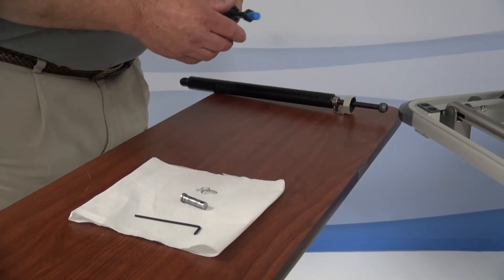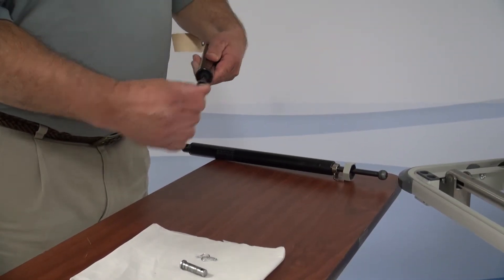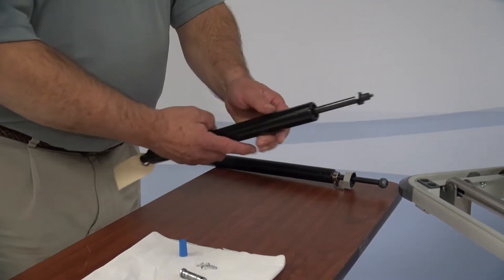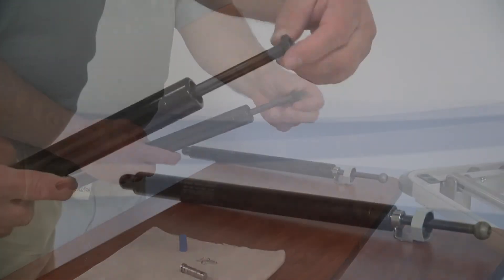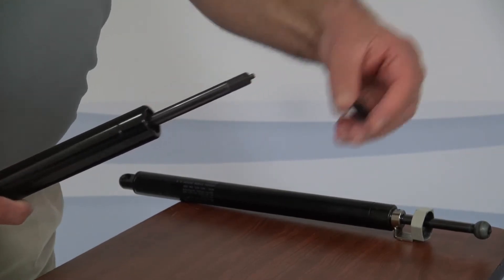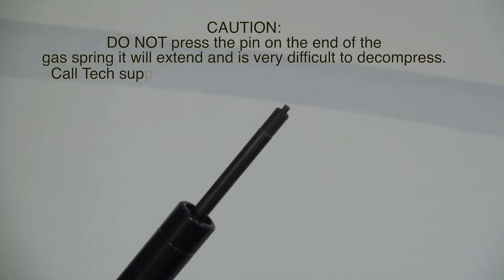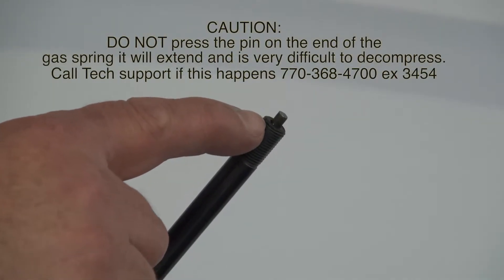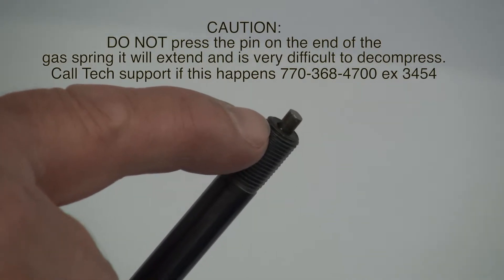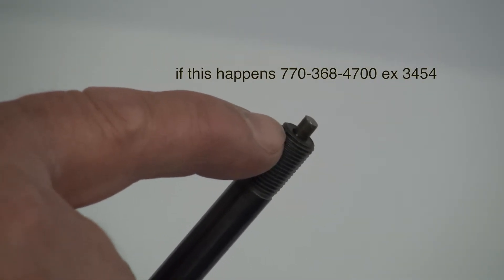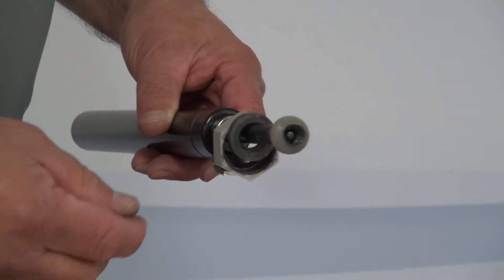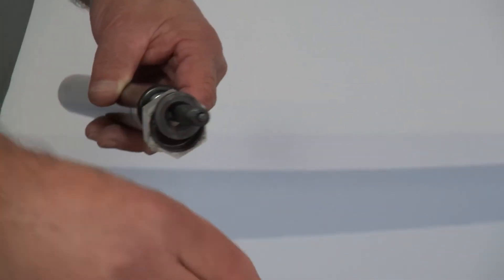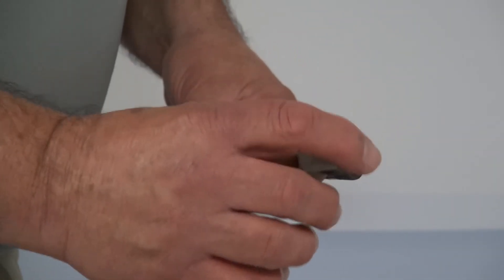Take the new gas spring and remove the blue cap. Next, unscrew the nut on the gas spring and discard. Remove the parts on the old gas spring to reinstall on the new one. Replace these parts in the same order as you took them off.